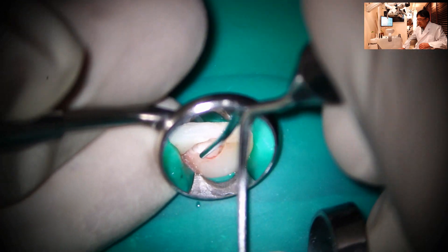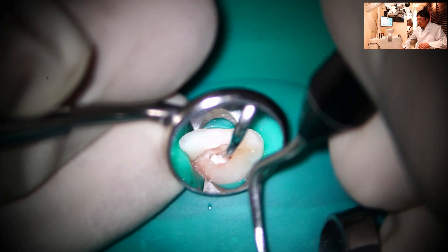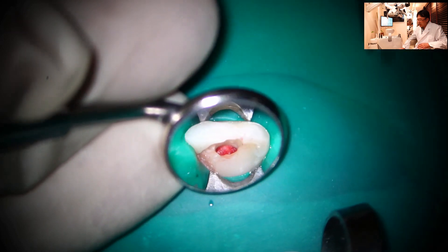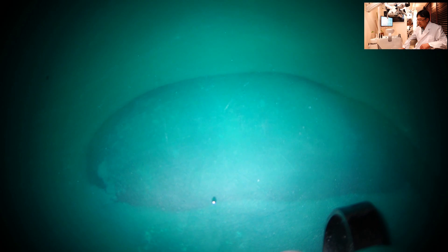So I'm pushing it a little bit down to the blood clot. Then I'm going to place MTA.